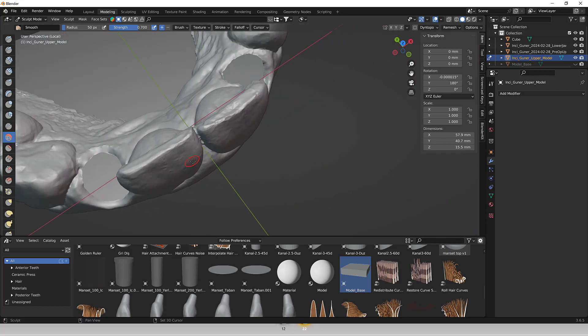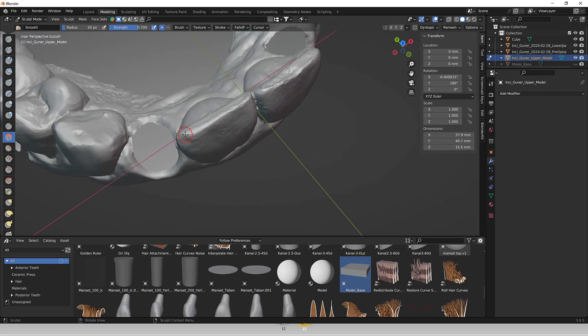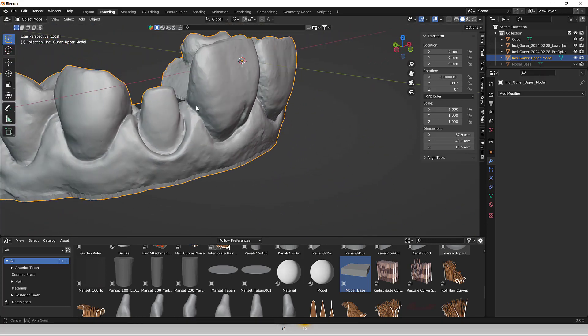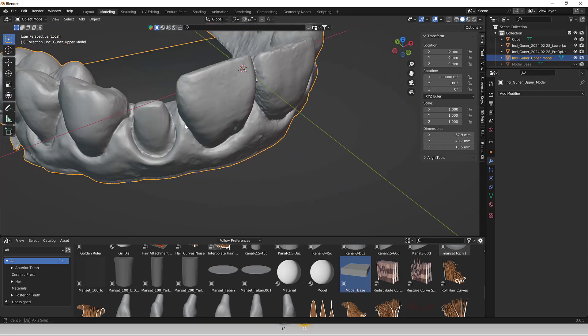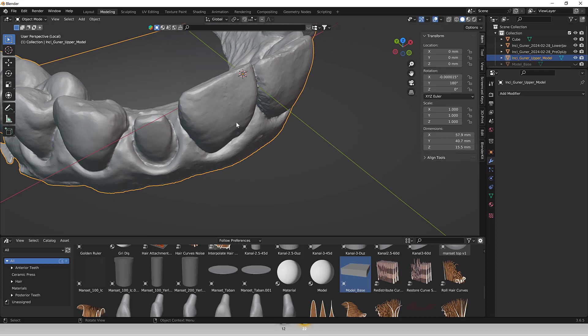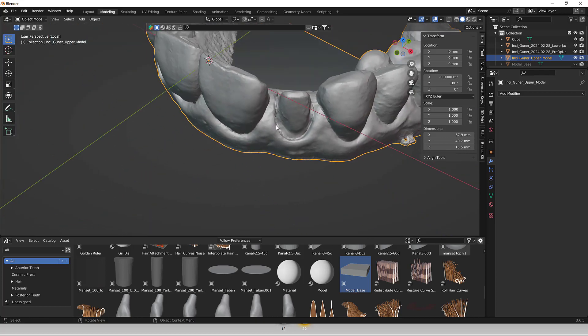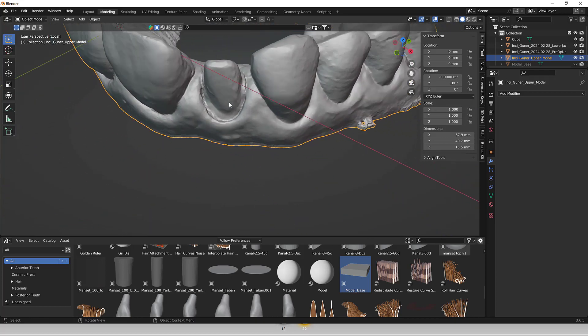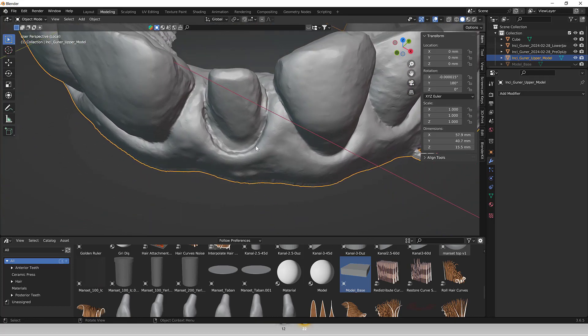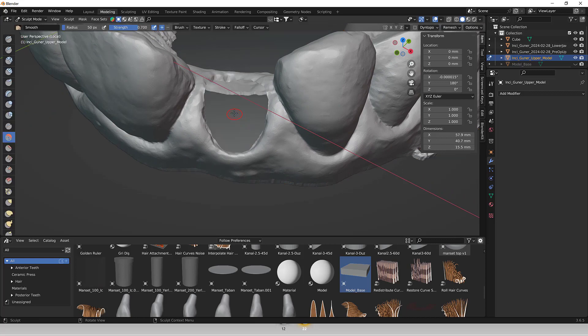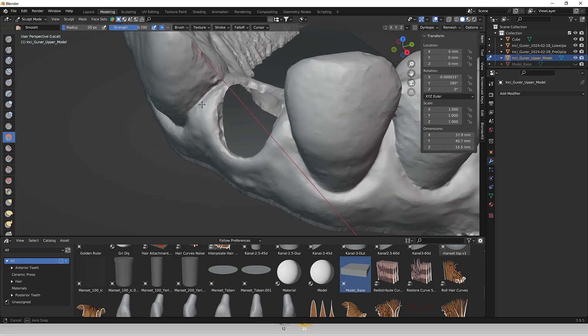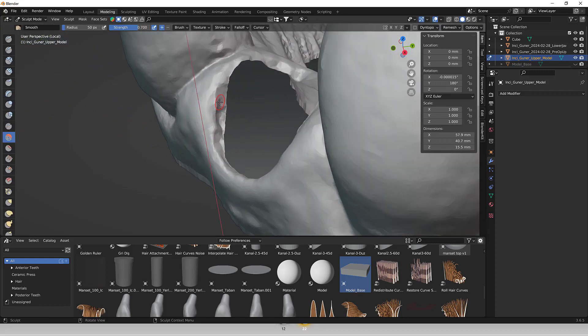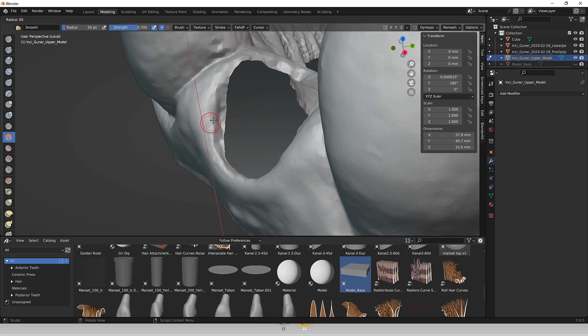Blender supports Boolean operations which are essential for combining, subtracting, or intersecting different 3D shapes. This capability is beneficial for creating complex dental models or modifying existing ones to fit individual patient needs.